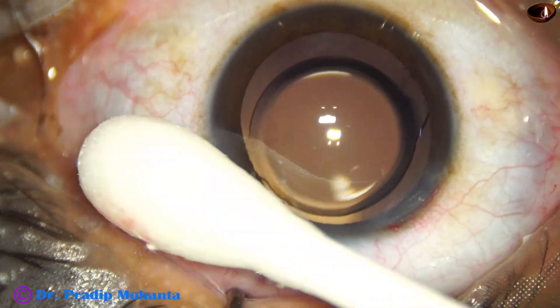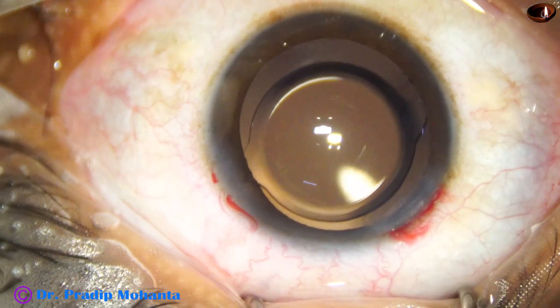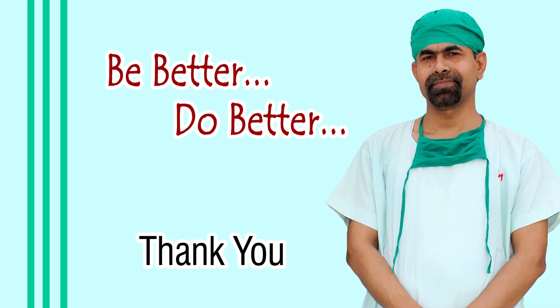In such cases we should try phaco aspiration. Thank you very much for your attention. I hope this video will help you in developing your surgical skills. Be a great surgeon and serve your patients with love, respect, empathy, and great surgical competence.